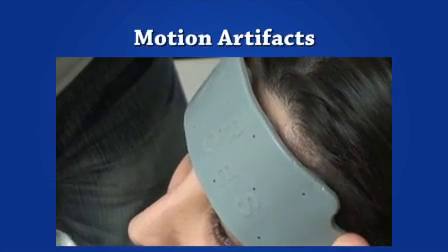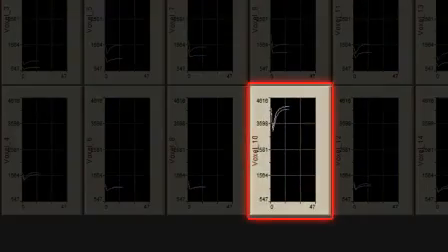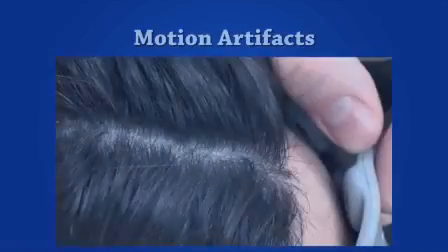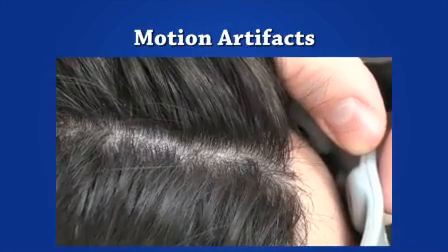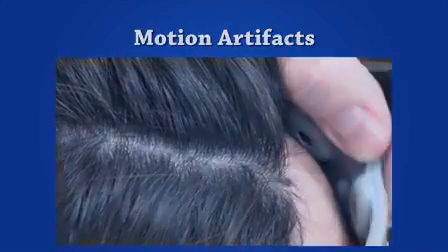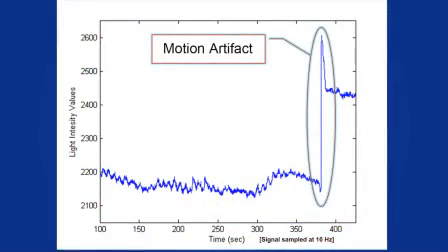Furthermore, if the light source loses coupling with the skin, the detector may record either very low values, since no light may pass towards it, or extreme high intensities and momentary saturation, due to the reflected light from the surface of the skin. Similar saturation effects may happen if the detector pops and loses contact with the skin, causing ambient light to leak. Head movement can further cause changes in the pressure applied to the sensor pad or to the light sources and detectors.